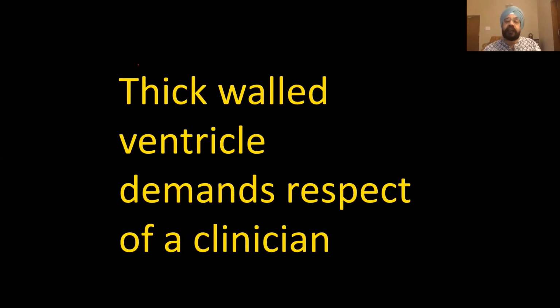Now, please explain the physiology behind triphasic mitral inflow. The kind of L wave you showed, and you said this is very specific for a variety of hypertrophic cardiomyopathy, how is it produced? So the triphasic flow, where between the E and A there is a very prominent L wave. Actually, it is much more than L wave. It is found in actin filament mutation. It is because of delayed relaxation of the left ventricle.